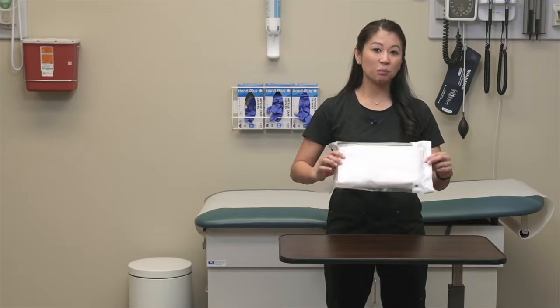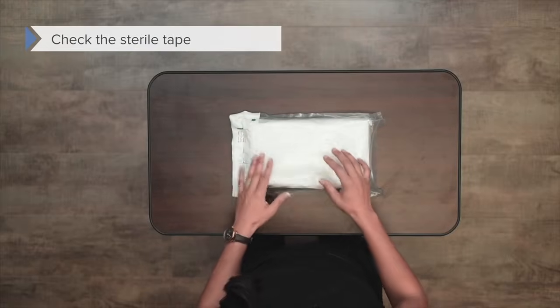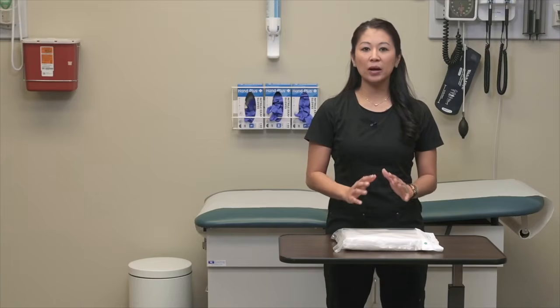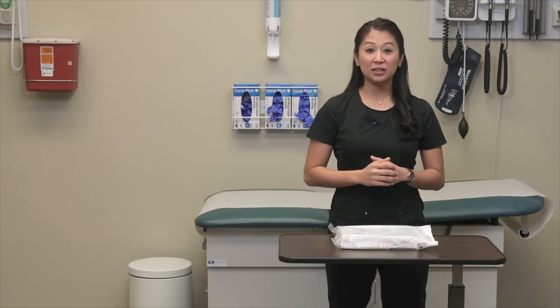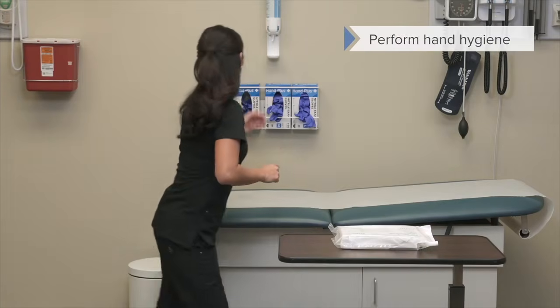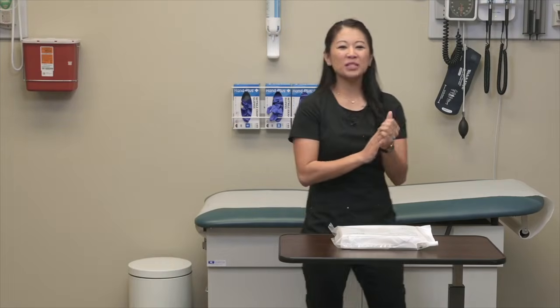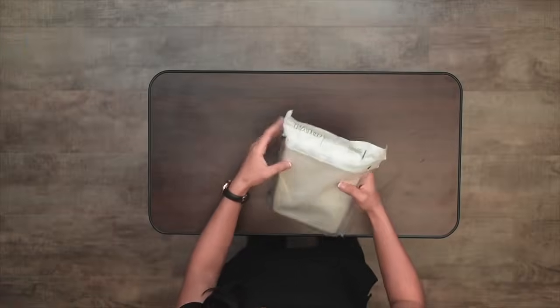Also, some sterile equipment, for example, may have a sterile tape like this. If it does, make sure this is intact and not opened. That way we can ensure sterility of the equipment. Now, once we've inspected our package, let's open our sterile kit. And first, we're going to perform our hand hygiene. Now, once we do this, we can remove the plastic covering of the package.